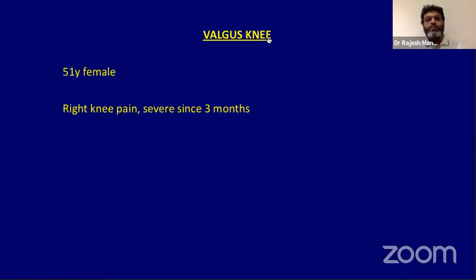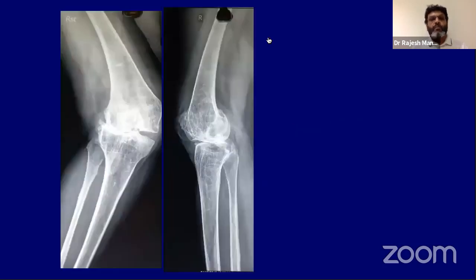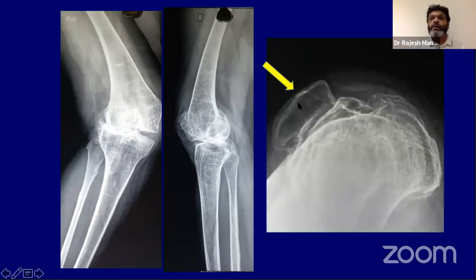It's a patient with a valgus knee, a 51-year-old female with severe right knee pain for 3 months, overall ongoing for a long time. She had a 30-degree valgus deformity, the opposite side a little less, range of movement from a 15-degree deformity to 115, some amount of extension lag, medial moderate instability. Now, this was the pre-op X-ray. The most important thing to note here is that you can't see the patella in front of the knee. The patella was sitting all the way laterally.